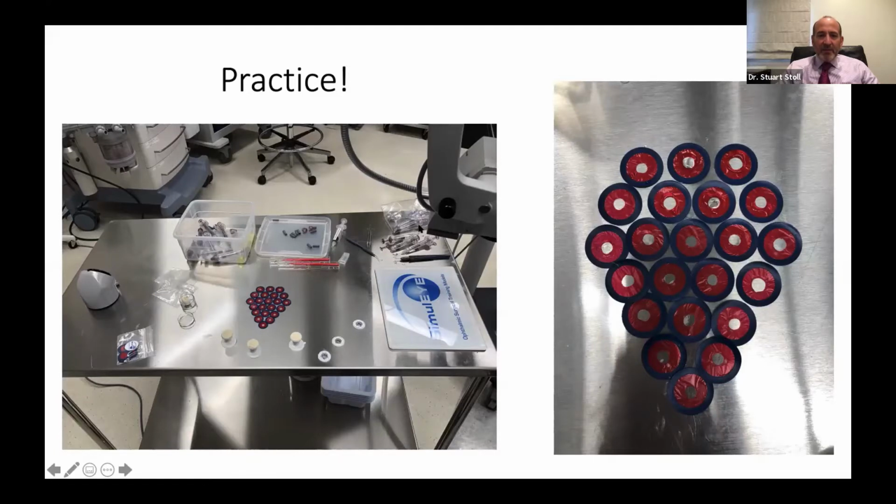I grabbed some instruments, some viscoelastic that we save some visco sometimes at the end of cases. If I know I'm going to need to use some, we'll just use any viscoelastic that maybe got open but didn't get used. It's going to get thrown away. We'll grab that. You can use other sources of gel. And look, here's 22 tears.